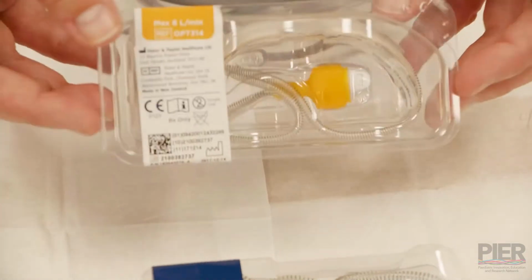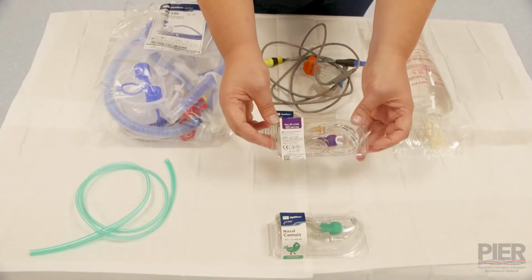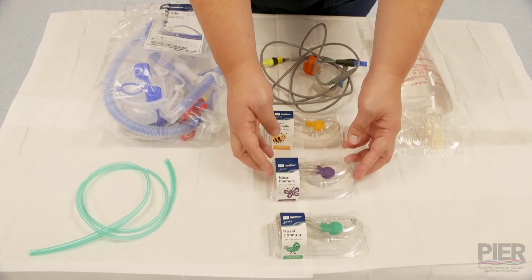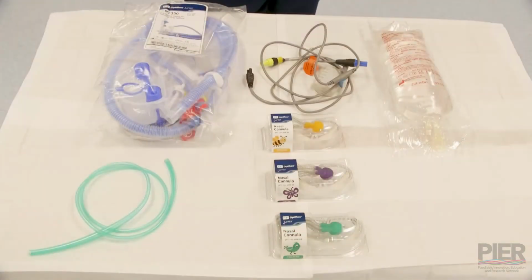Each of these prongs comes with a maximum flow written on the back of them. So if you look at the back, it will tell you the maximum flow that you can deliver through these, and assess the size of your child's nostrils depending on which size prongs you would need.